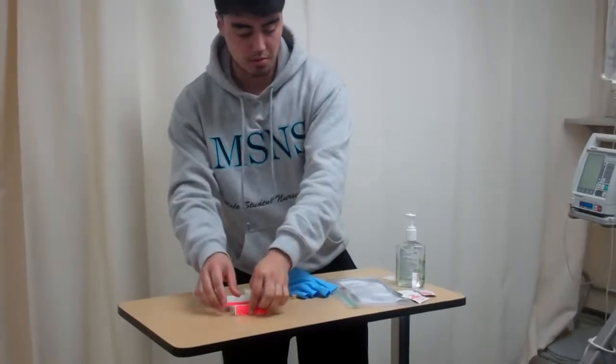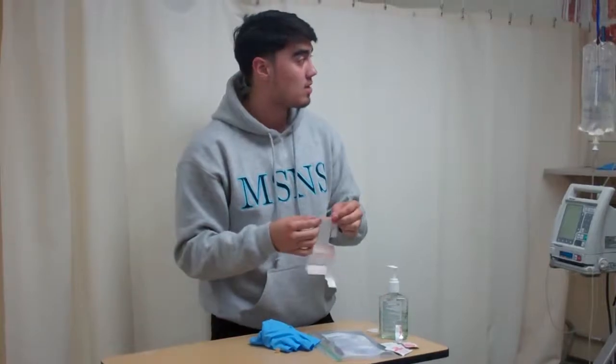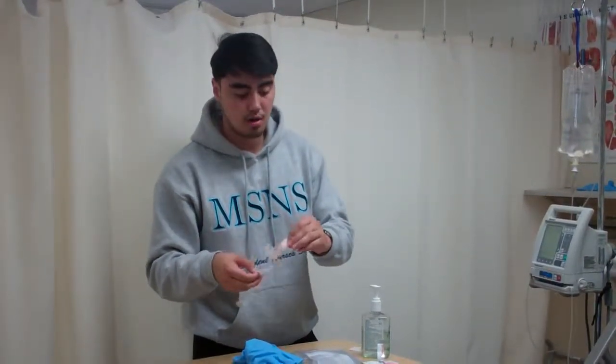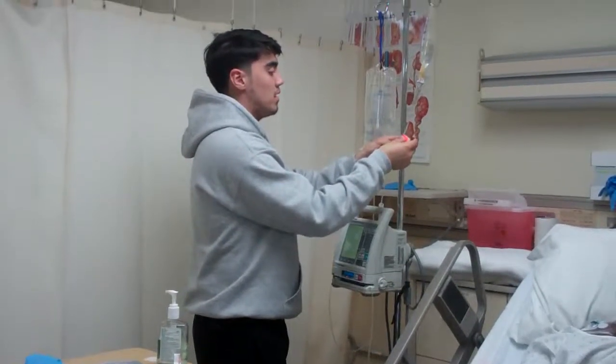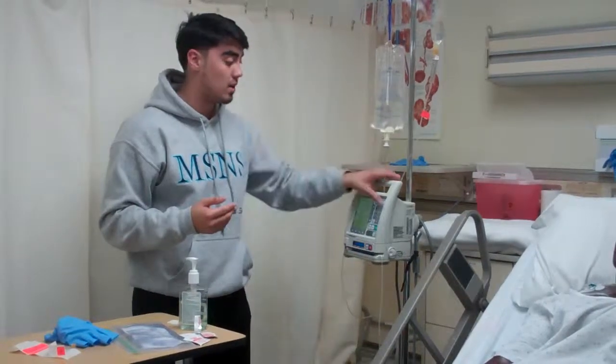What we want to do is get the tubing sticker, and the sticker is basically going to say when we attach the secondary line with the piggyback, and we're going to put the date, the time, and also our initials. So I'll go ahead and place this on here, so that other nurses know how long the tubing's been hanging out for. So now that I've done that, I'm going to go ahead and mark that I've given the medication, and I'm going to document all of the things that I've done. And then I'm going to ask the patient before I leave if they have any more questions about the medication or if they have any concerns. And if not, then I can go ahead and document outside.